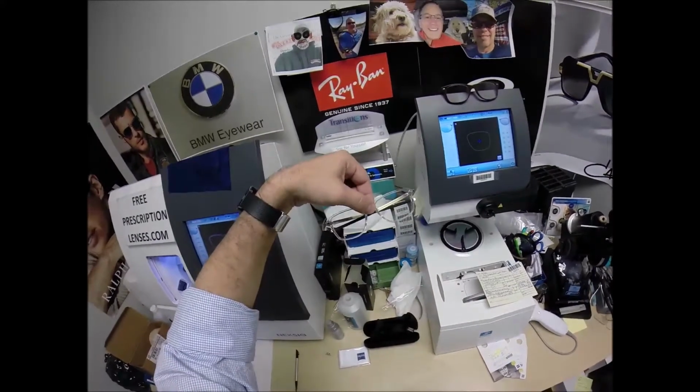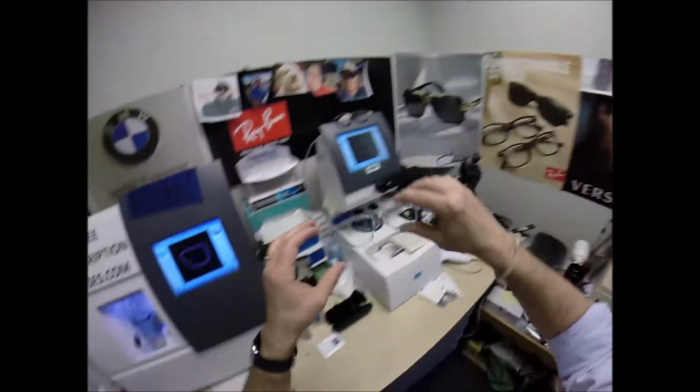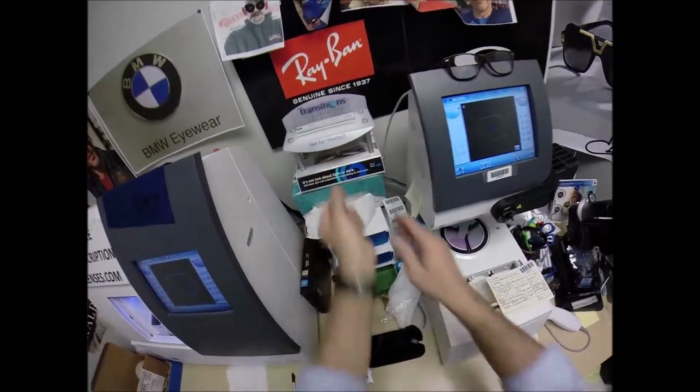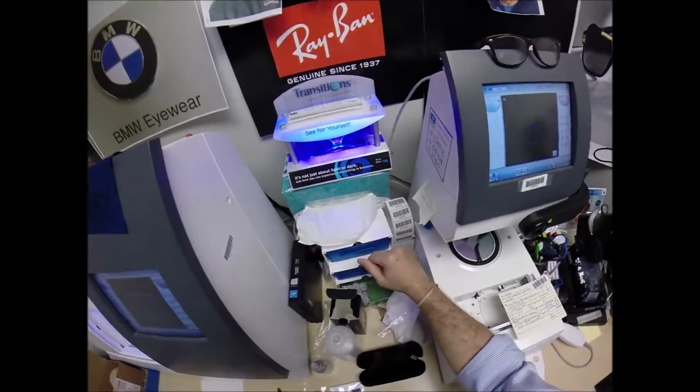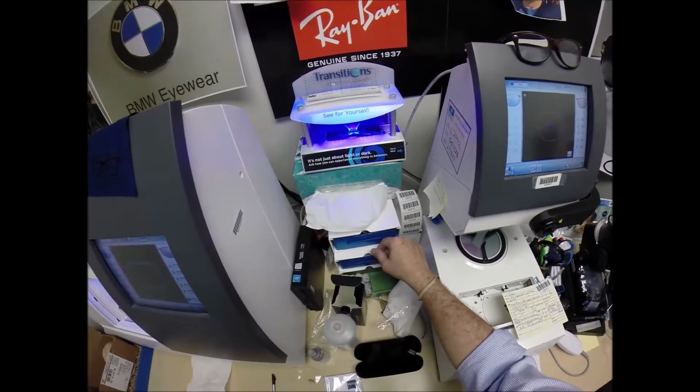So I'm going to go ahead and expose them to a strong burst of ultraviolet light. This is what they look like indoors. And now I'm going to turn them dark. As you can see, it takes about 30 to 45 seconds for photochromic transition lenses to darken, a little bit longer when you come back inside, 45 seconds to a minute 15.